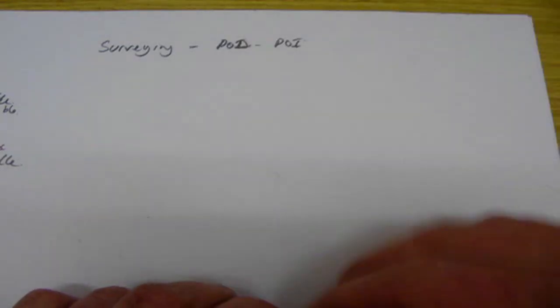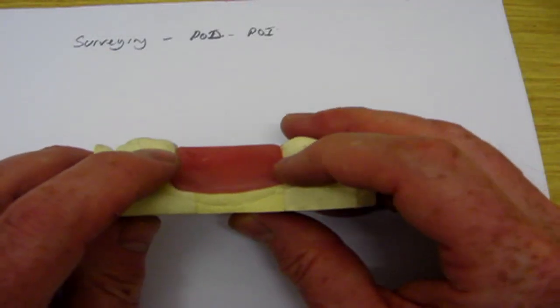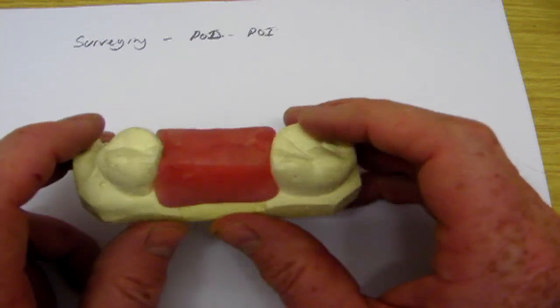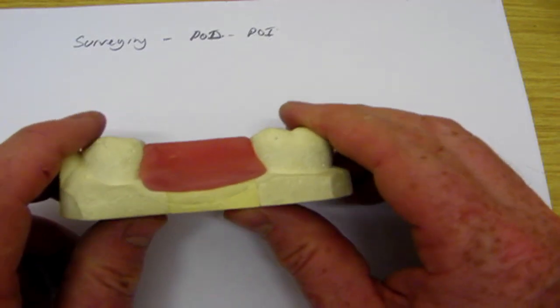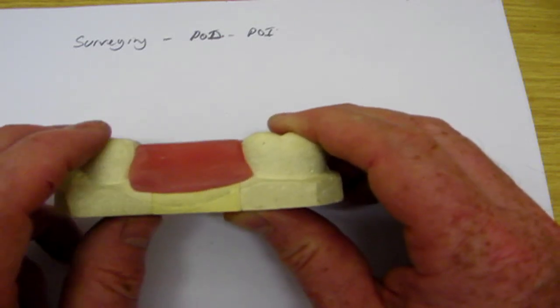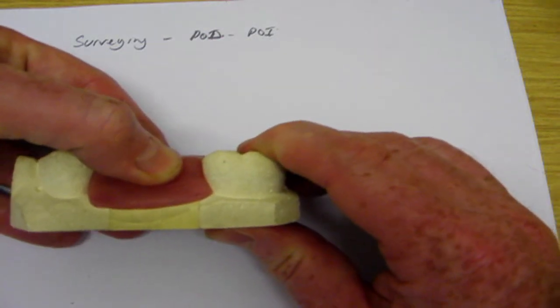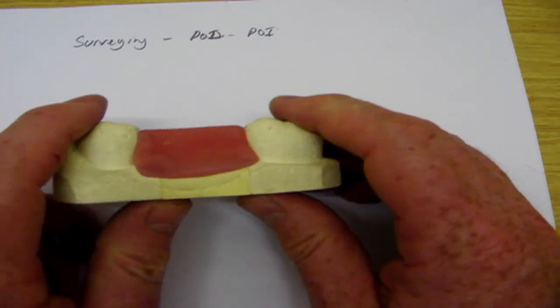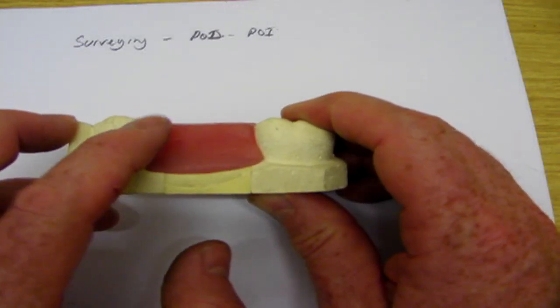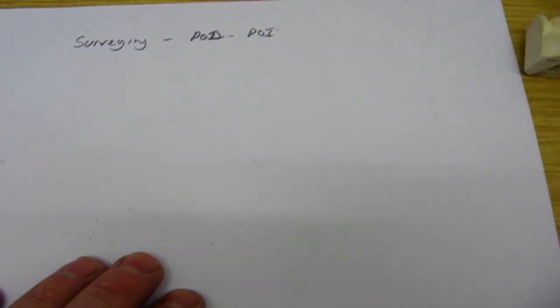Okay, so the scenario that we were looking at was where we had a bounded saddle, and we know we've got undercuts mesial to this molar and distal to the premolar, and if we made our denture in the laboratory such that it filled these undercuts adjacent to both of these teeth, we'd find that we had excellent retention but not a very practical denture, because you can't get it in and out. You've actually created a little dovetail joint. Okay, so one extreme, not very practical.